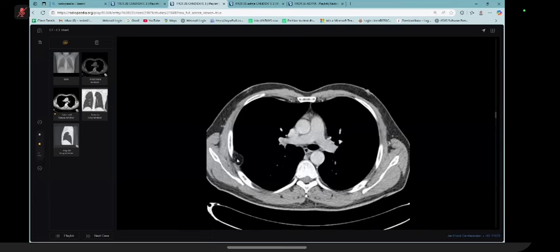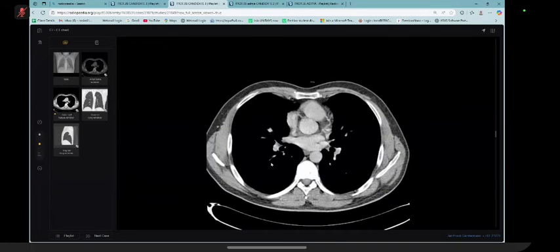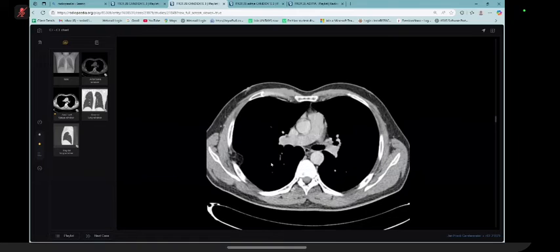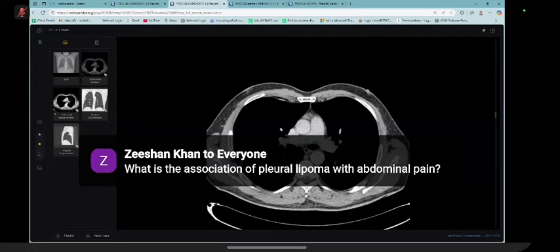After that, once you have the CT scan and have looked at it, you need to say that I can see a pleural-based fat lesion. In the end, you need to say that I will refer this patient to the MDT with a note that there is no definitive internal aggressive potential, no rib erosion, no other similar lesion. Those are the pertinent negatives you need to say.